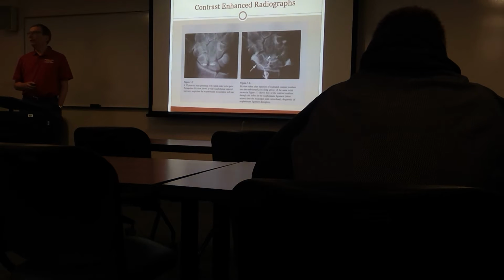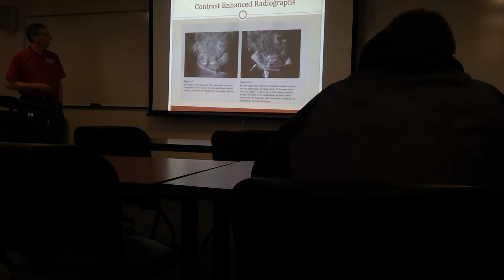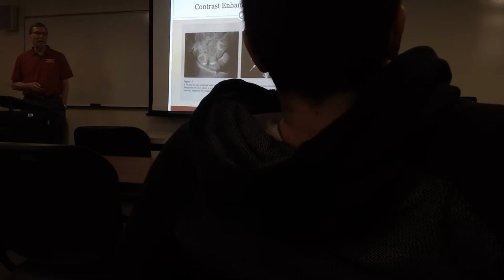Joint capsule, TFC, could be a fracture in one of the bones. In this case, we end up seeing a really nice disruption, scapholunate dissociation here. Okay. So the dye will then leak out. So a lot of times you can have a standard film done and they'll inject that radiopaque contrast dye in there.